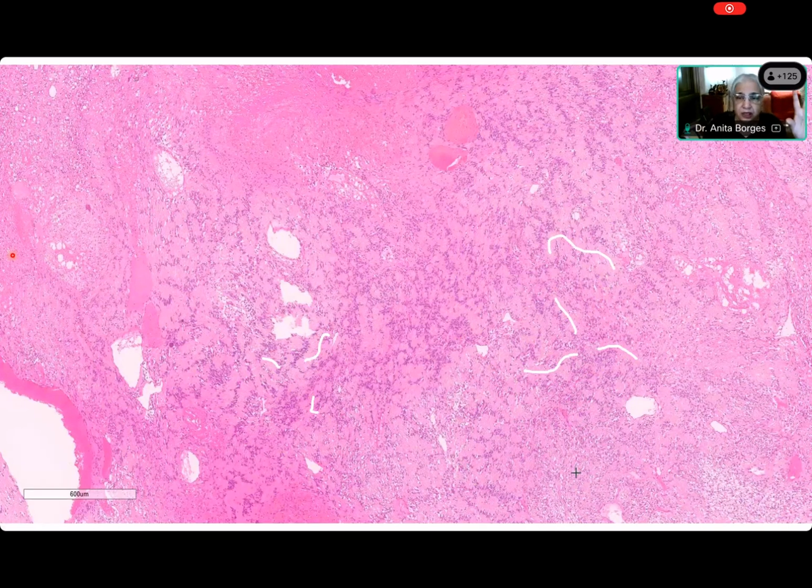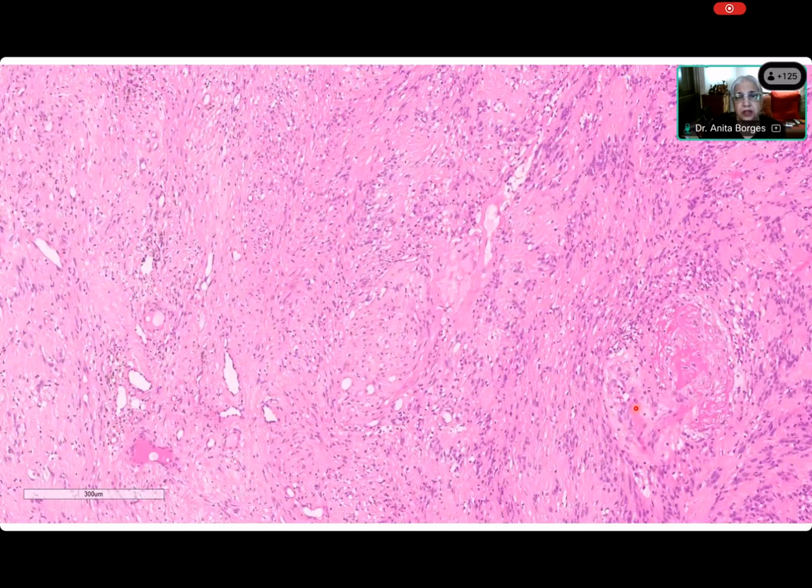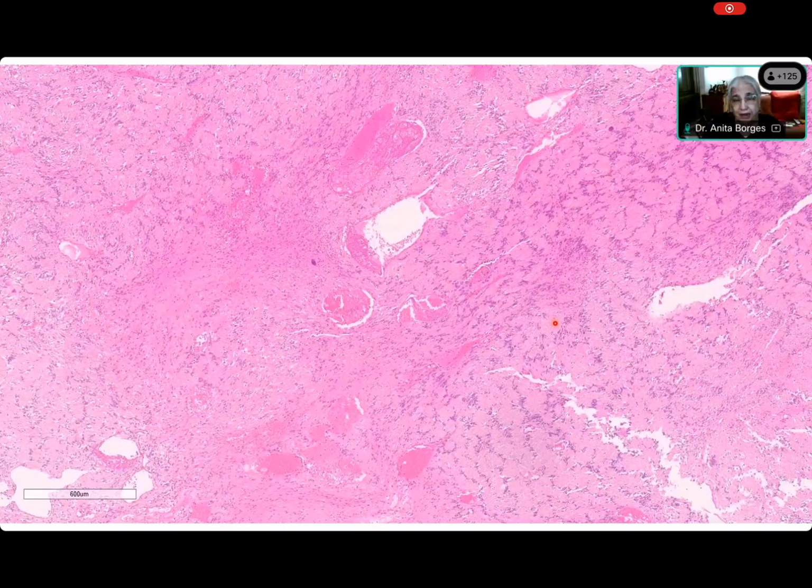You may call them Verocay bodies, or they're not specifically Verocay bodies, but you may wish to call them that. But what I'm telling you is that Antoni B areas are loose. This is collagen and it is dense. That's what you have to understand. Okay, so this is what you thought, Saida, was an Antoni B area. It is not. Now what are we coming across over here? Suddenly we are beginning to see the palisade. Oh, we forgot to mention that there was palisading, right? Yes, ma'am. Palisading. Yeah, this is a very palisaded tumor.